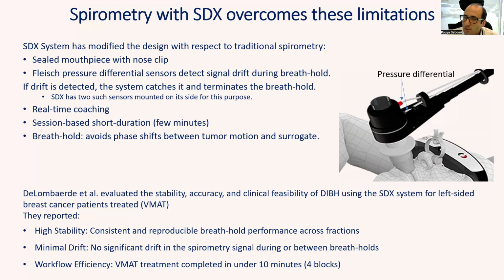In terms of workflow, it's built around short duration breath holds, which can help minimize the impact of baseline shifts over time. It also offers real-time coaching, which may help the patient stay more consistent from fraction to fraction. And since it's using breath hold rather than free breathing, it does avoid some of the issues that I mentioned regarding the phase shift between the internal motion and the external surrogate.